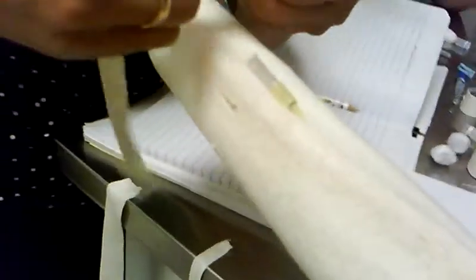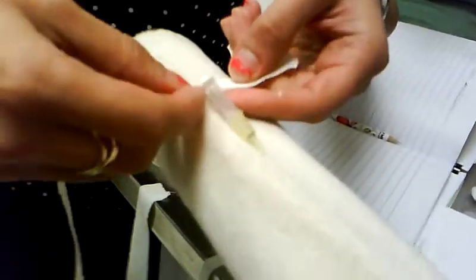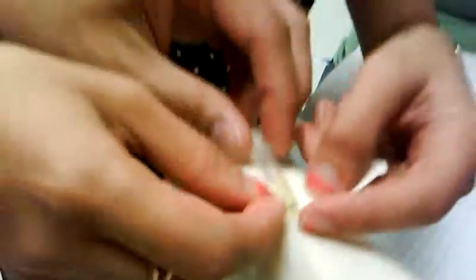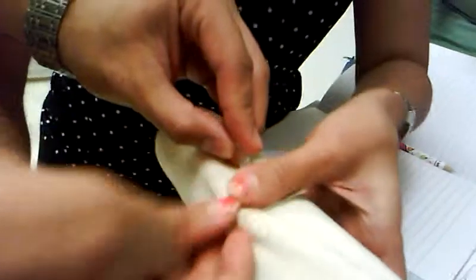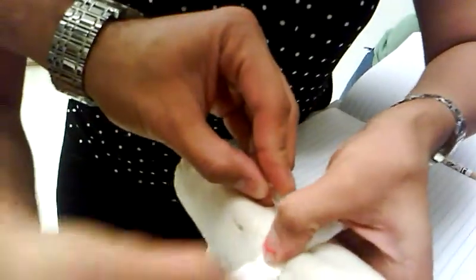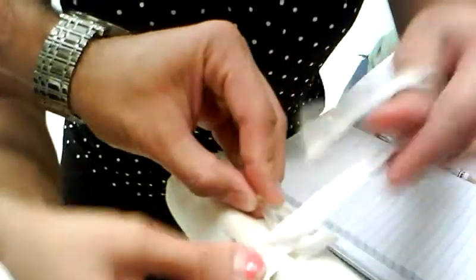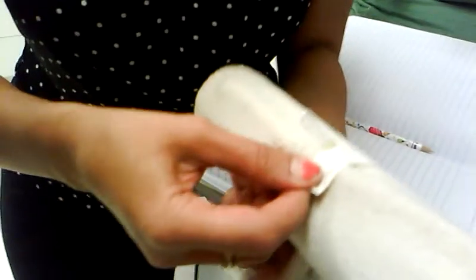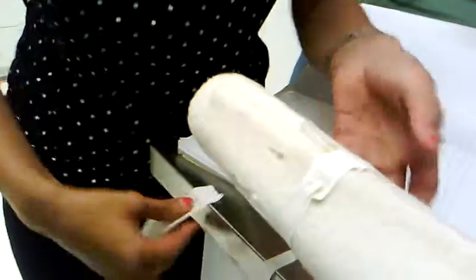Will you restrain this one so she can shave the leg real quick? I'm going to do it from over there. Good job, Karen. And then this one, and then go over, and then all the way around. Good job, Karen.